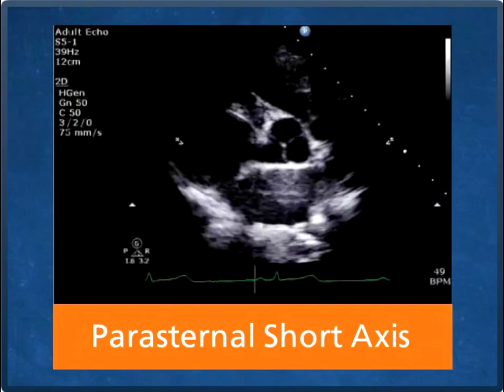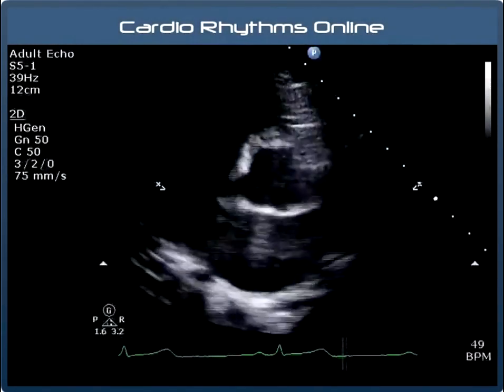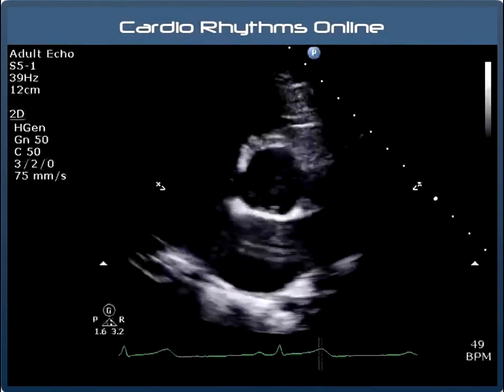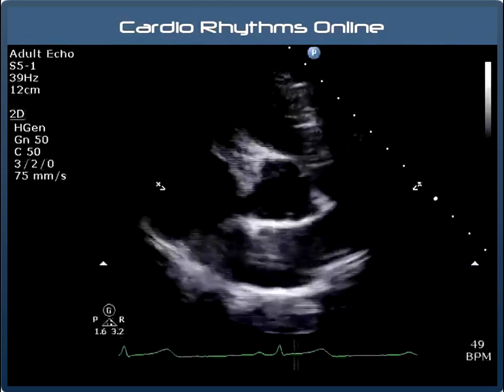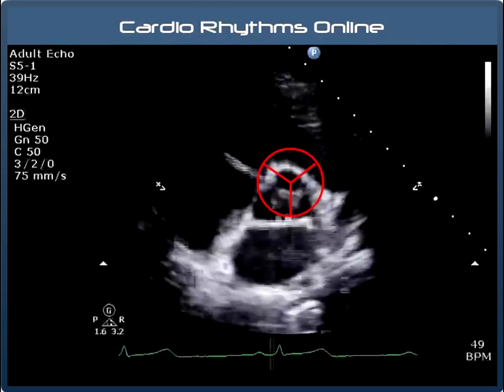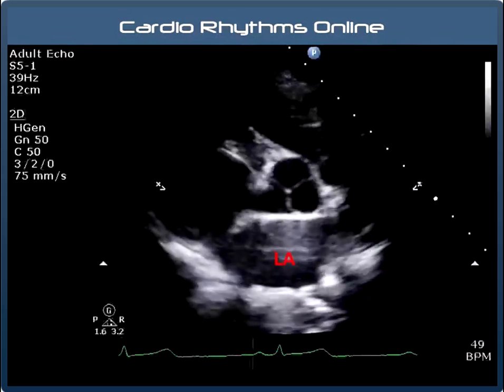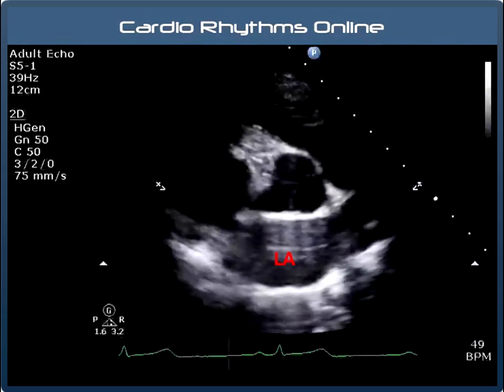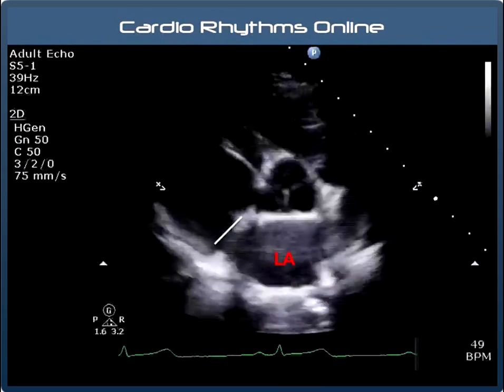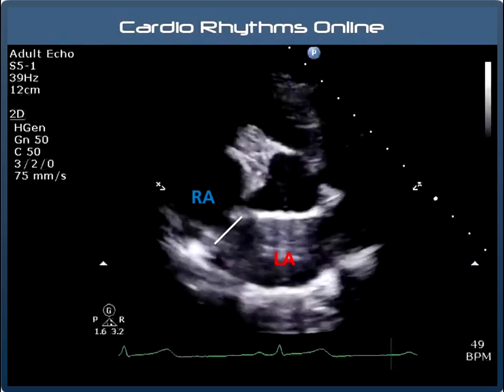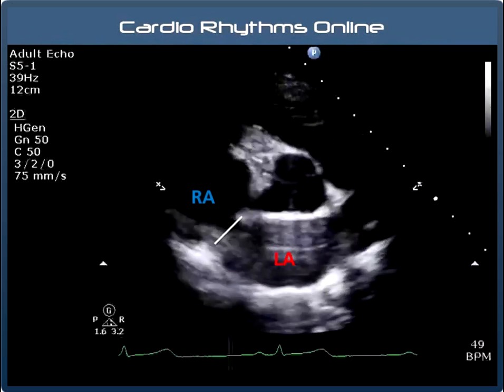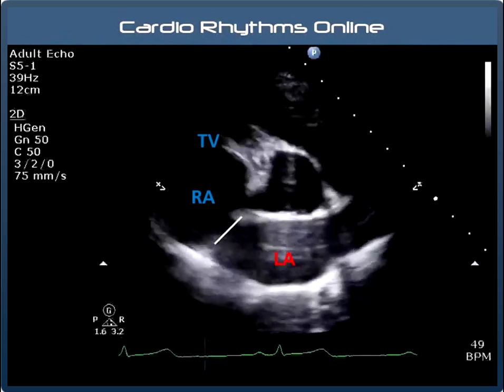With the short axis view, the transducer stays in the same place, but now we simply rotate it and angle it so we can view the aortic valve head on. You should be able to see all three cusps of the aortic valve — it looks a bit like a Mercedes sign. Here then is the left atrium, the atrial septum, the right atrium, the tricuspid valve and the right ventricle.